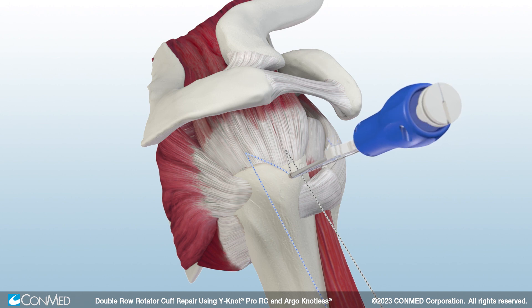Next, hold the white cleat and turn the blue handle clockwise to insert the anchor to the laser line. Then, uncleat the sutures from the white suture cleat and the retention ribbon from the back of the handle.